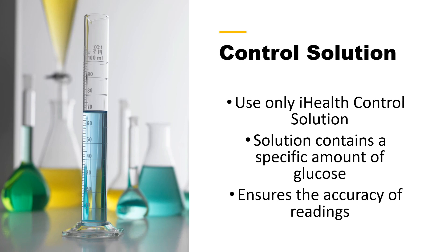Control solution — a couple of things to keep in mind. We always want to use the solution specific to the meter that we're using. In this case, we're going to use the iHealth control solution. I will include a link in the video description where you can purchase that. The solution contains a specific amount of glucose, so we know exactly how much glucose is in there, and we know the range that reading should come in.